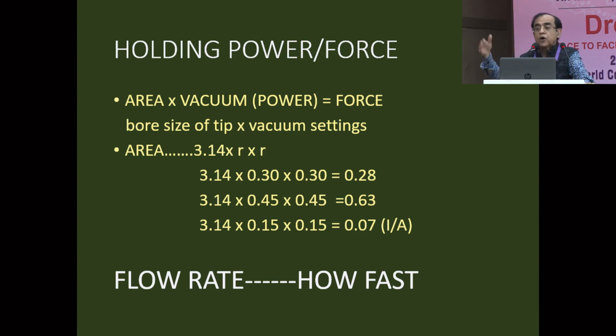And flow rate decides how fast the things are going to happen. How strongly you will hold will depend upon the vacuum.